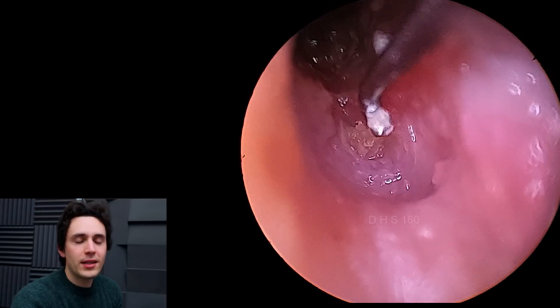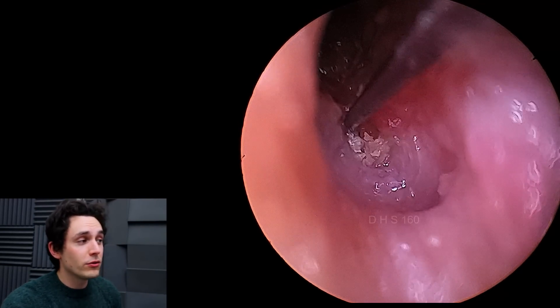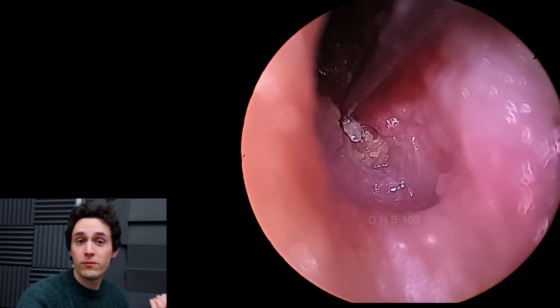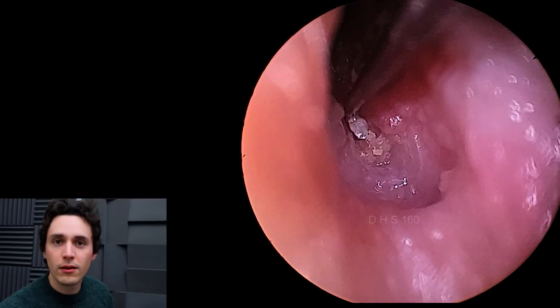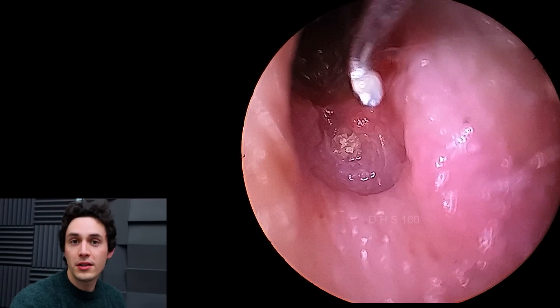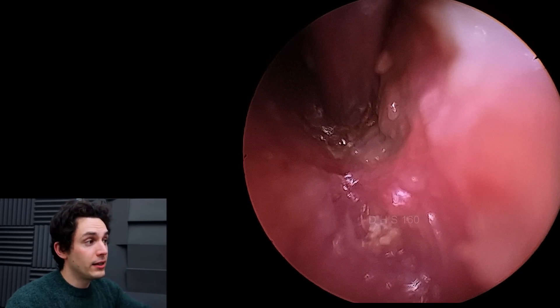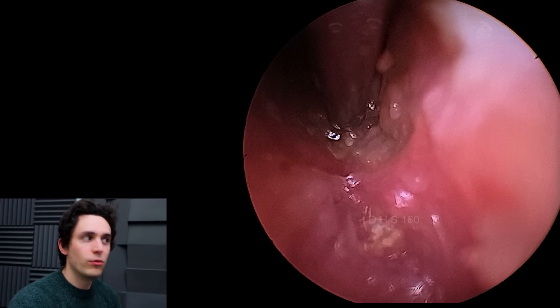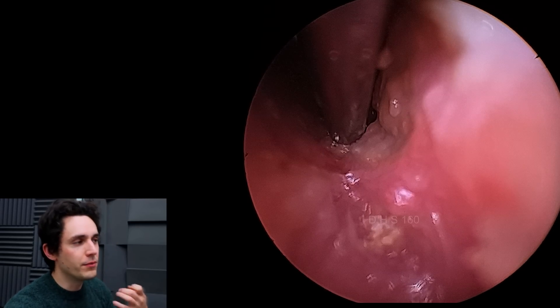What I'm really doing is having a feel of it, and that is, I would suggest, quite a good diagnostic thing to do — because what you're feeling for is that classic spoon-on-brick tactile sensation that you get in your hand when you're scraping against bone. It's very different. And if you ever do come across it, you will know instantly when you feel it, because it is very, very hard. It's unmistakable.